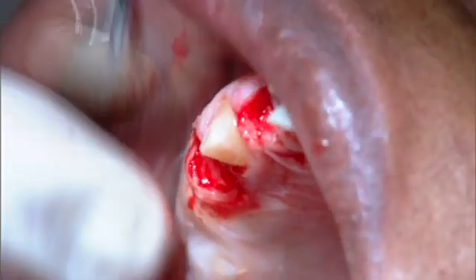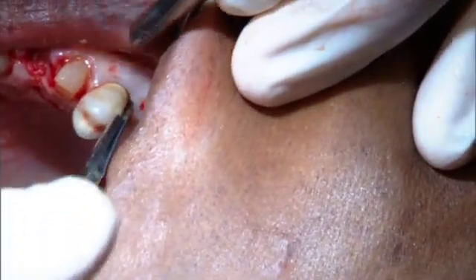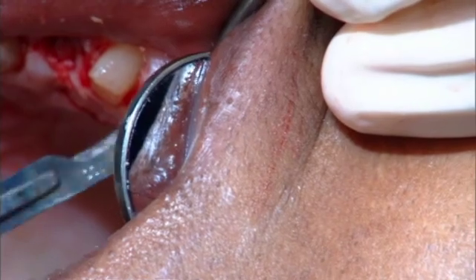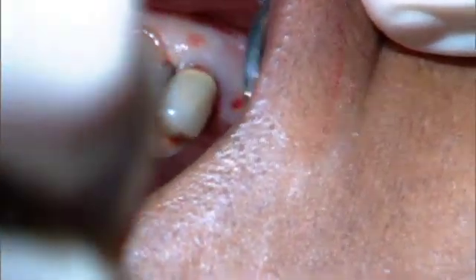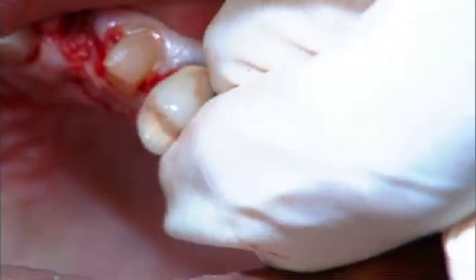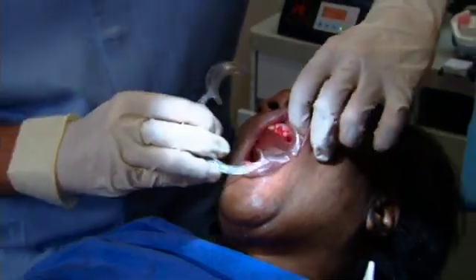So we've preserved a lot of the soft tissue. Let's turn this way for me now, and we'll do the same thing on this side. This tooth really doesn't have a lot of bone on the distal. I want to preserve as much as I possibly can. Same thing. We've got the teeth out. We elevated a little flap on this side because we went after a root tip.